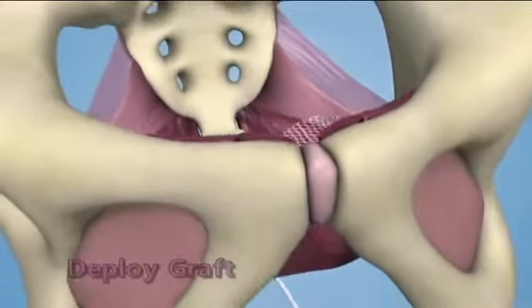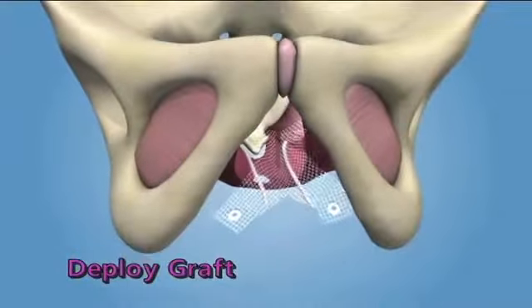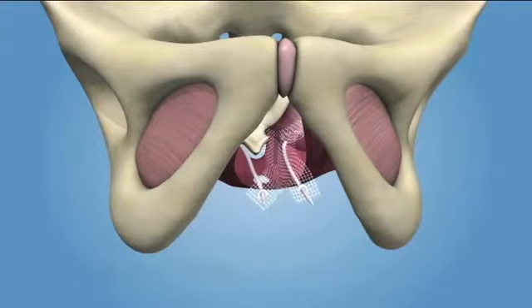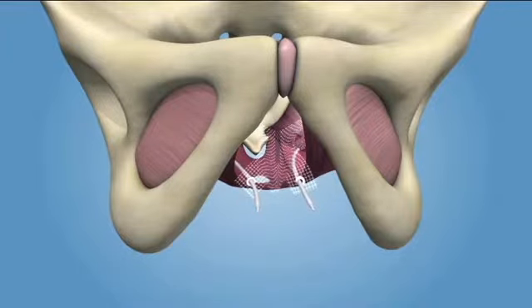Deploying the graft. To deploy the graft, locate one of the loose eyelets on the graft body and slide the apical fixation arm anchored on the same side through the center of the eyelet. From the top side of the graft, pull the fixation arm through the eyelet and repeat on the contralateral side. Feed the previously placed sutures through the graft at the proximal tail of the graft.